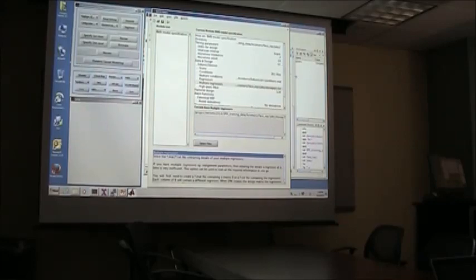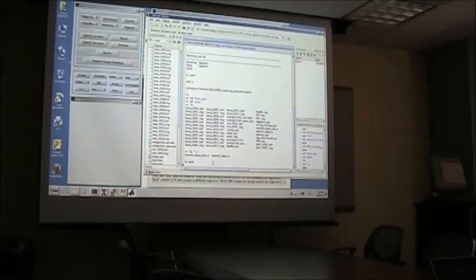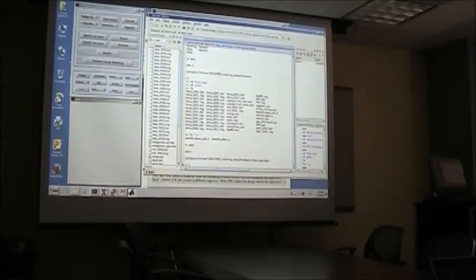Yeah, but did you already move it, Hank, instead of just copying it? Did you actually move it potentially? You know what I mean? That could be. I thought I copied it with copy paste, but might be.